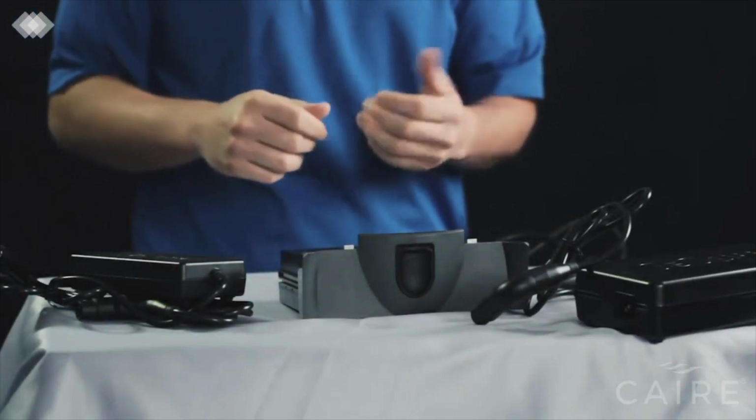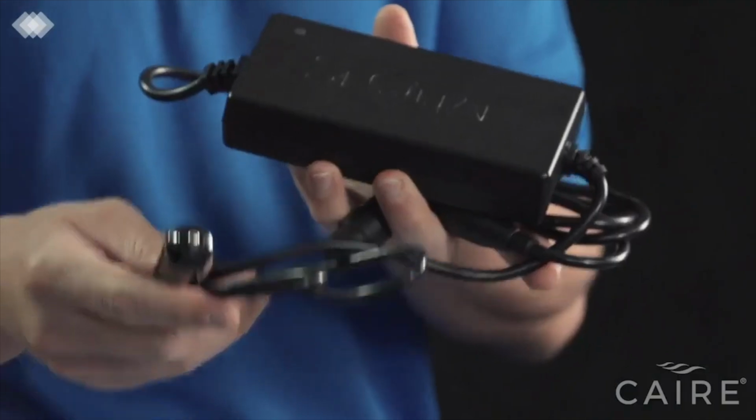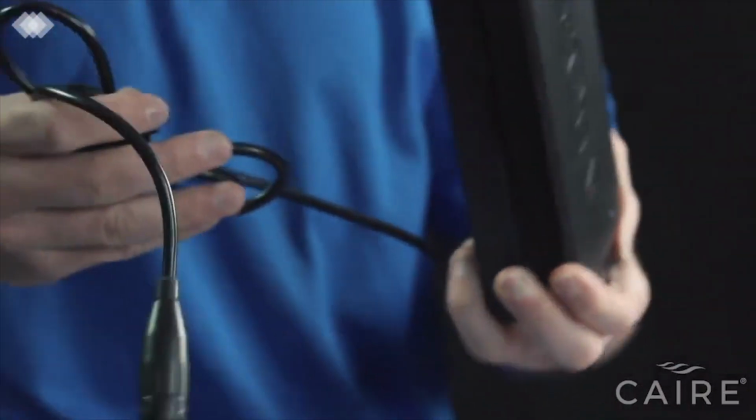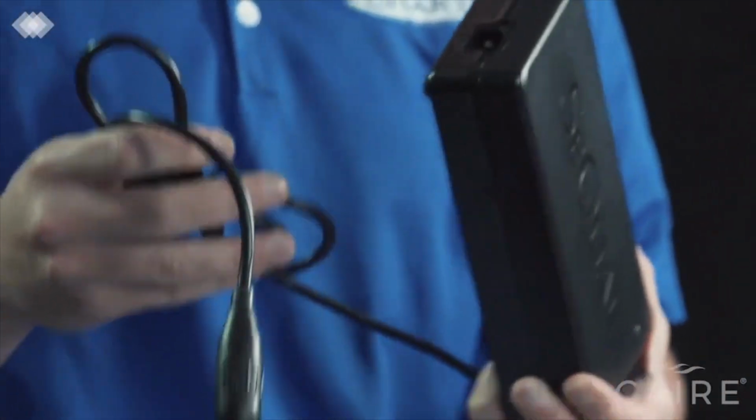We have a power supply that's a DC power supply. This is the smaller one. This is to run inside your car or vehicle. We have an AC power supply. This is used for installing in your home or charging the battery in a wall outlet.